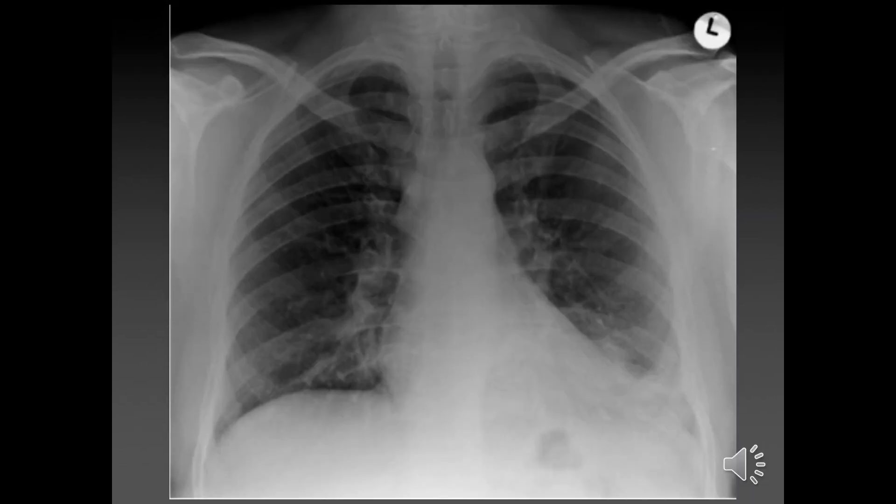Let me show what I mean. You can see the vertebral column here, and this is the heart. And behind it you can see the individual vertebrae — and that's what you want to be able to see. If you see all white and you don't see the individual vertebrae, that means it's under-penetrated, meaning the rays aren't getting through the intervertebral discs.